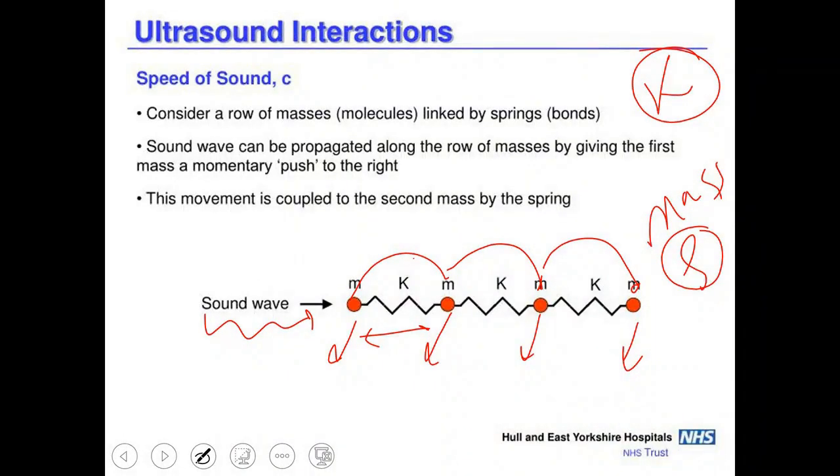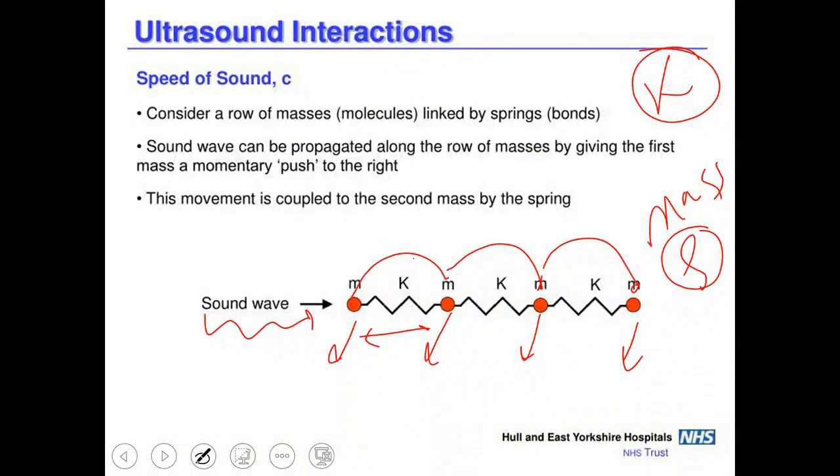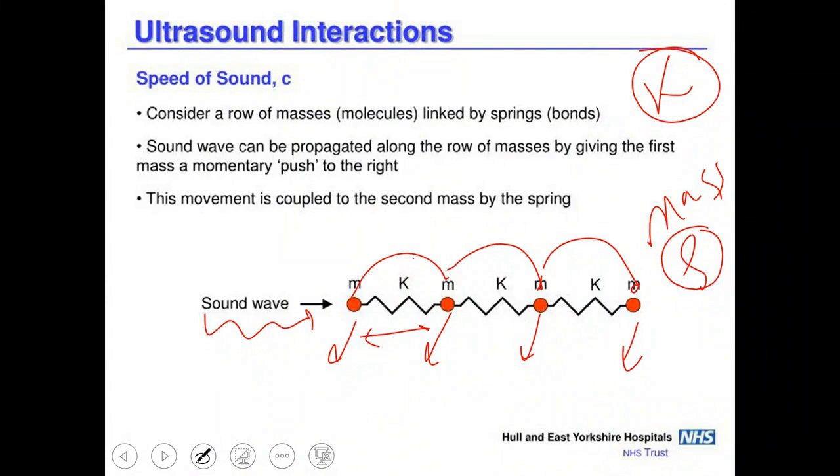It's like when you have one person holding the hand of another. If you push the first person, everyone holding hands will move together. But if there are people not holding hands well, and you push the first one, the energy won't transfer. This is the same idea that happens with the bonding between molecules, which I refer to as stiffness. Its effect is very high on the speed of sound waves or ultrasound waves within the medium. Its impact is very significant and greater than the density of the medium.